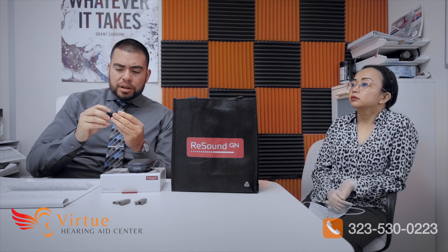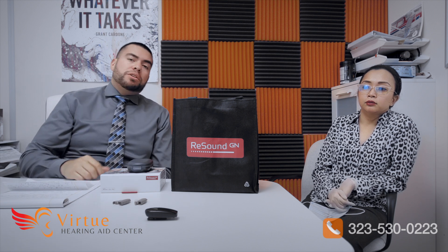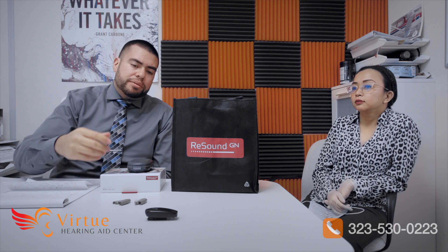The multi mic also has a third mic on top that you can place in the middle of a table — at a dinner or meeting — and you'll be able to hear everyone much more clearly. The range on this is about 80 feet.